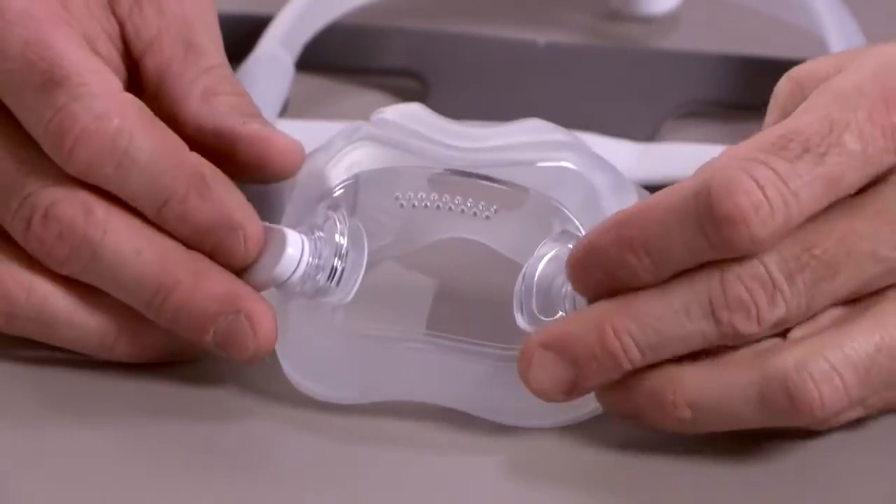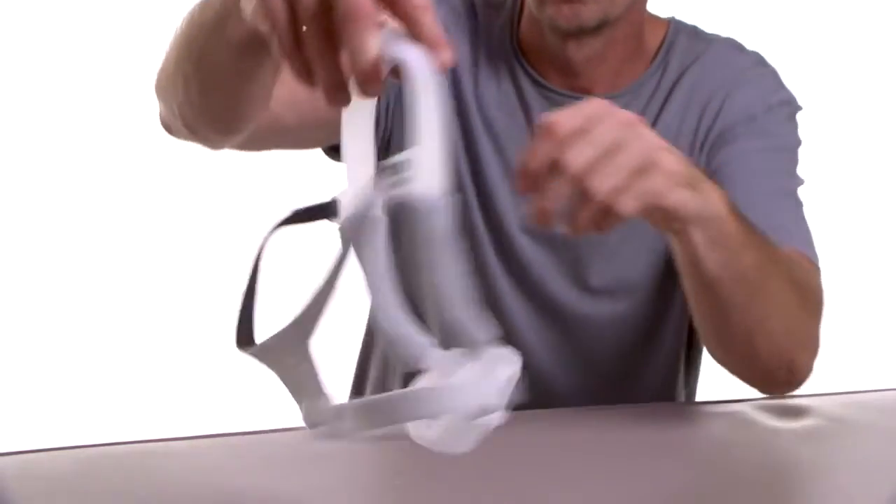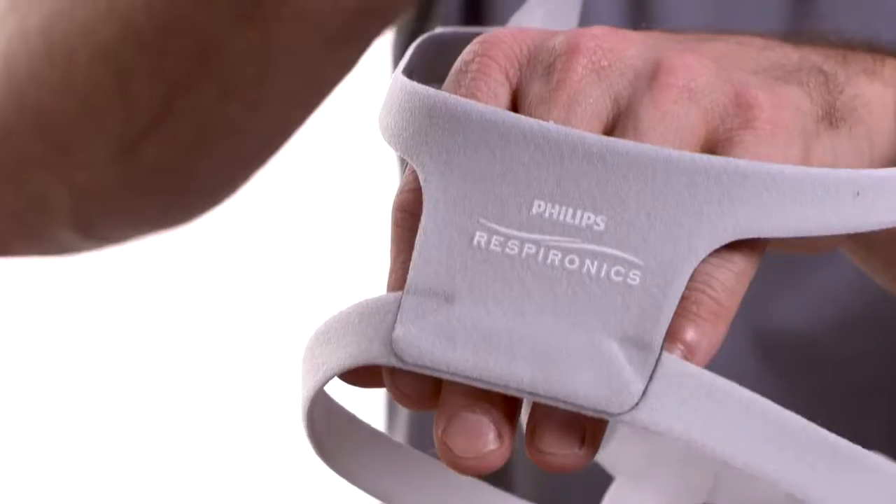Attach the magnetic headgear clips. When correctly assembled, the Philips logo will be on the outside facing up.